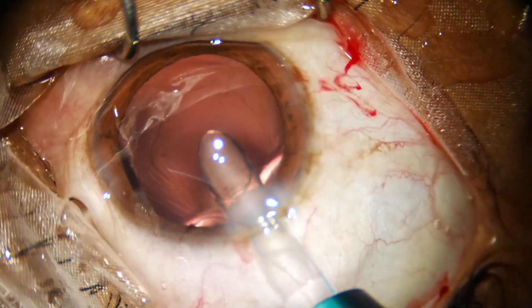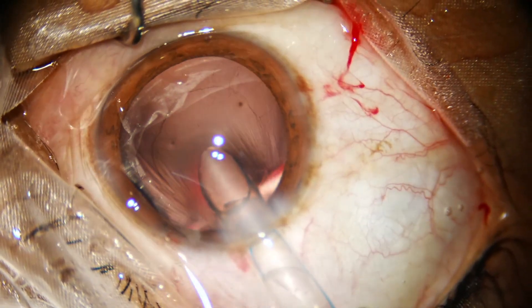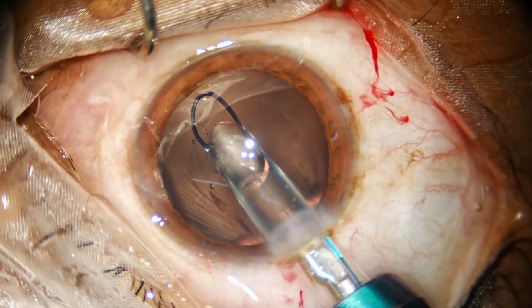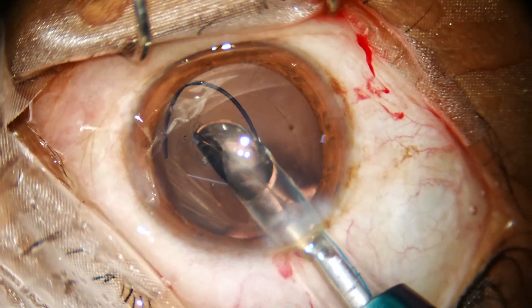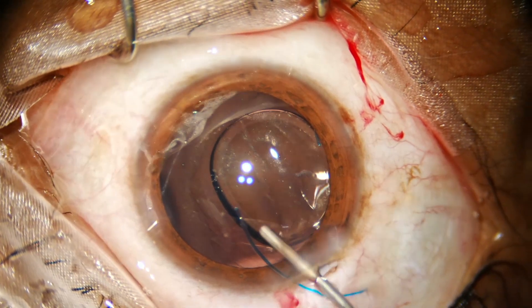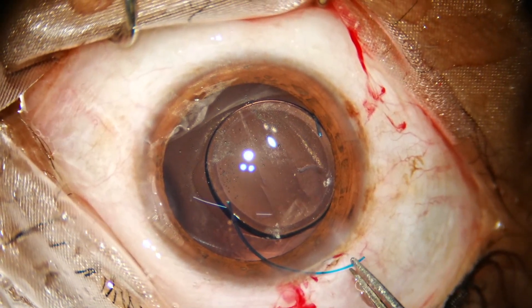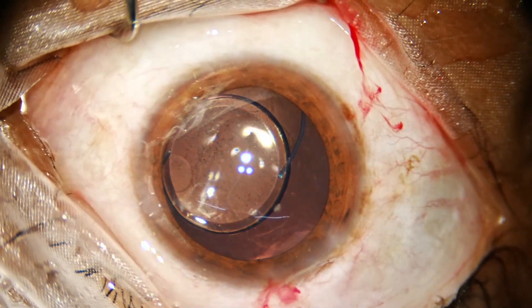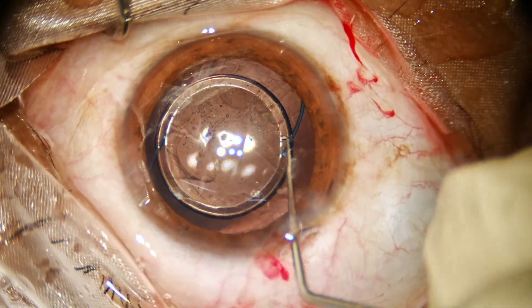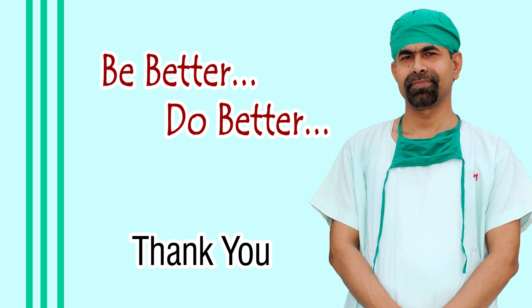With the left hand we hold the body of the injector, and now screw out the lens. Hold the tip of the injector and place it on the bed. Thank you very much for your attention — hope this video clip will help you in your practice.